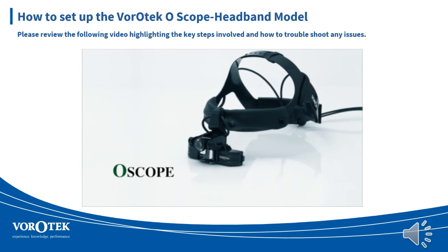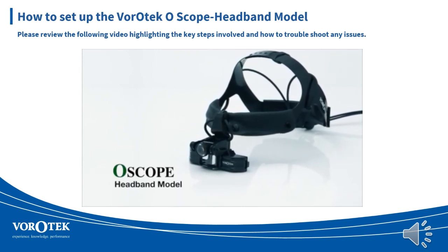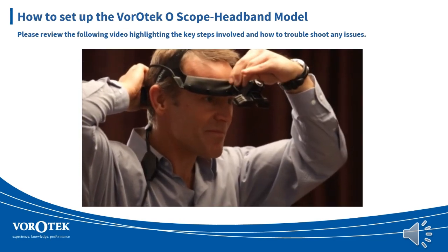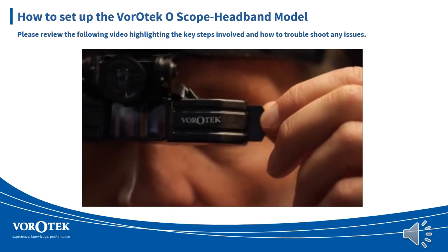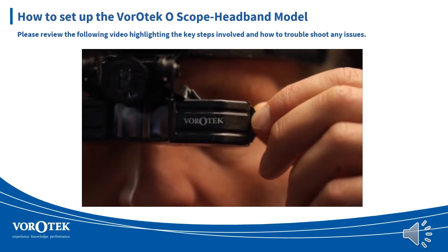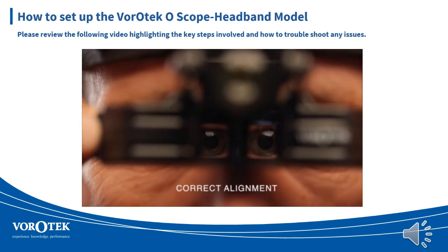This video is to ensure your scope is correctly set up and specifically aligned for optimal visual performance. To ensure correct alignment of the binocular optics with your interpupillary distance, you may need to adjust the mirrors within the optics to suit your eyes. This moves the mirrors to match your eye width. This is done by simply sliding the tabs located at each end of the converged binocular optics. The correct alignment will occur when your pupils are in the centre of the viewing screen.